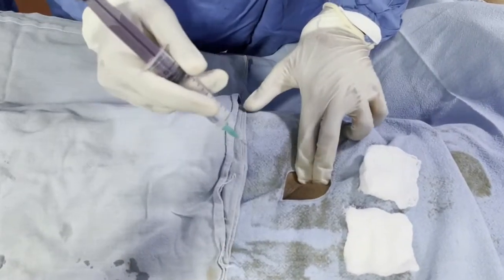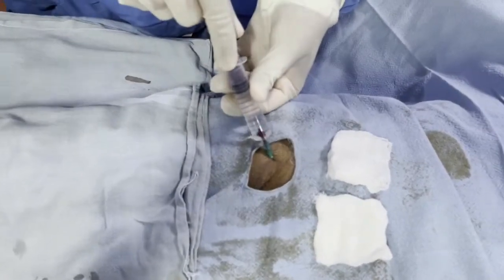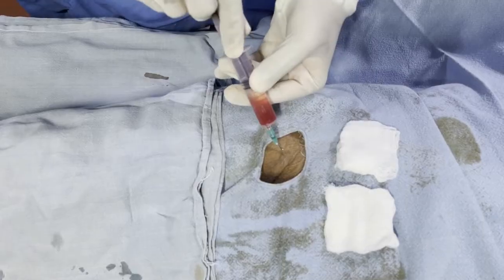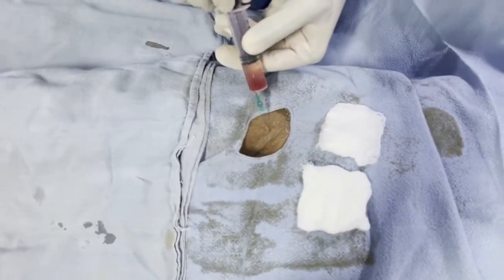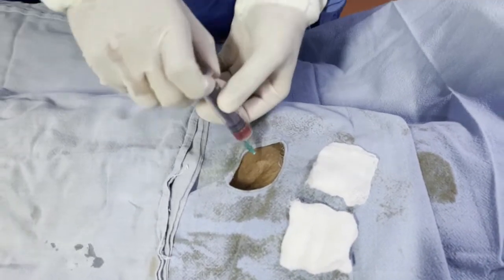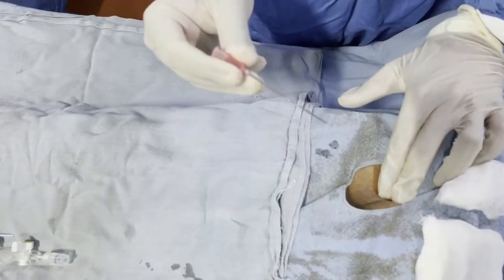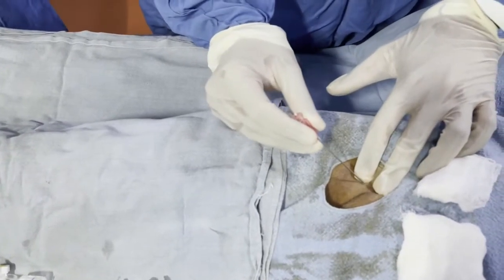Locating the femoral artery with our fingertips, we give the lignocaine injection at the various layers around the femoral artery. After giving proper anesthesia to that region, we make sure we are not going directly into the artery. If there is blood coming out, we do not inject directly into the artery, especially the lignocaine, which is harmful. So every time you inject, you withdraw.